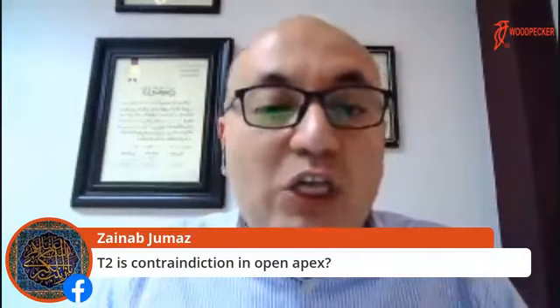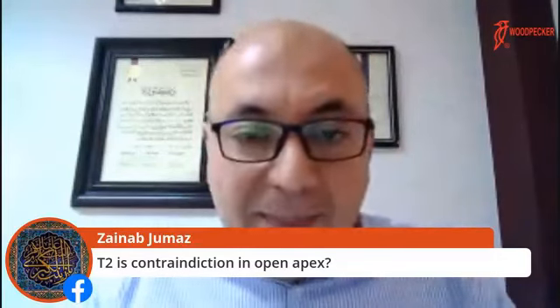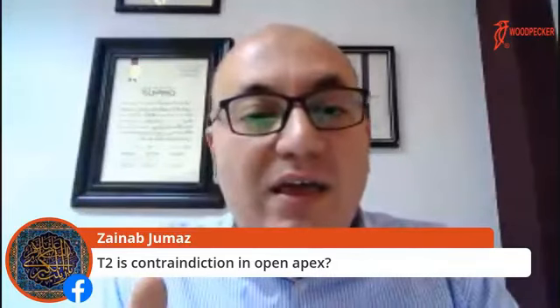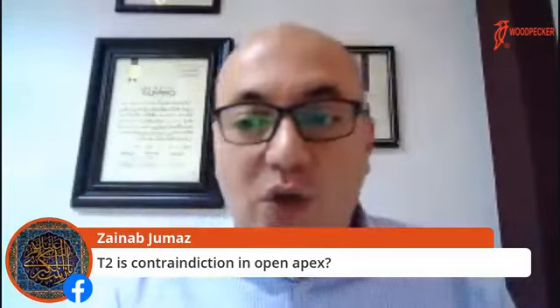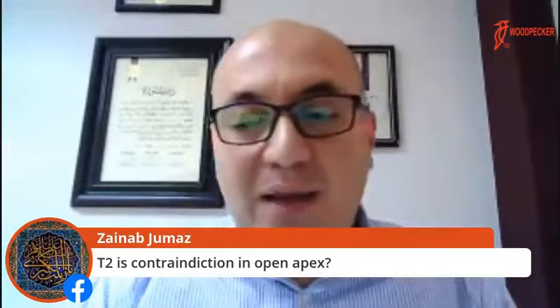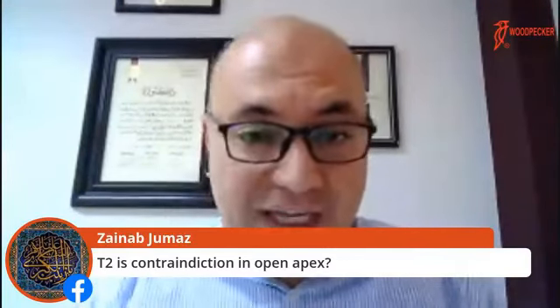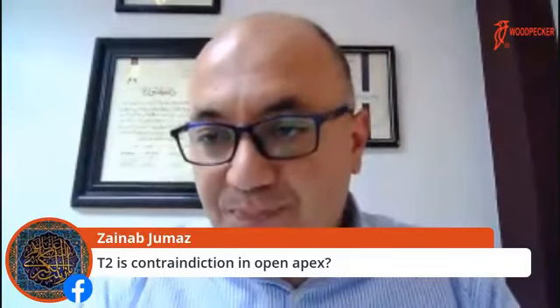So whenever you go, even if you go with your tip, and thank you very much for your question, out of the apex in open apexes, the liquids will stop at the level of the tissues, and they will not penetrate out of the apex. I hope that I answered you, Zainab, about the uses of T2 in active irrigation. I think you meant to ask about active irrigation.